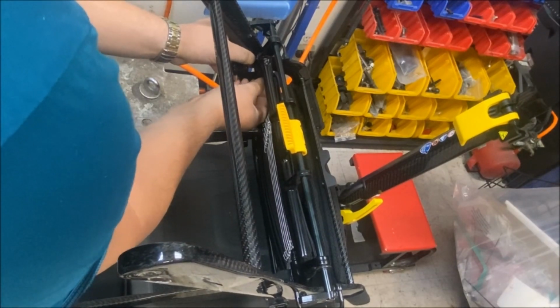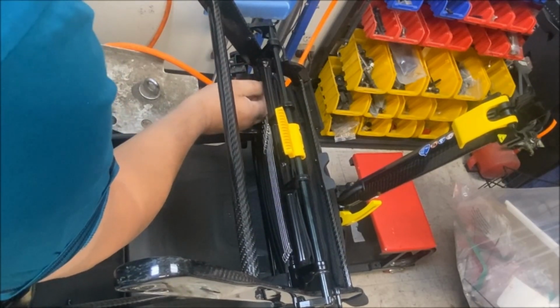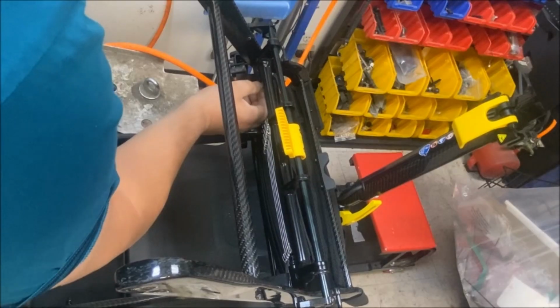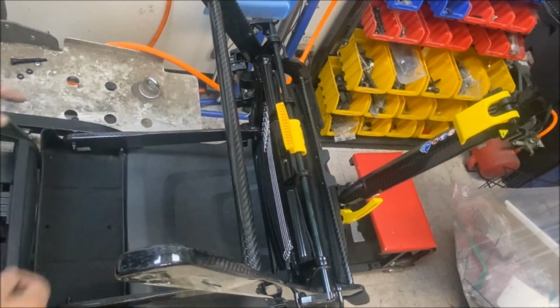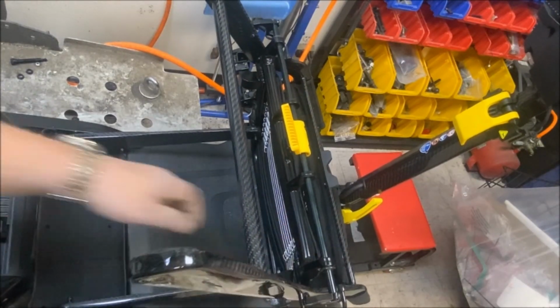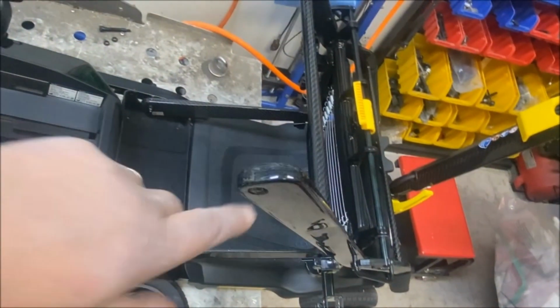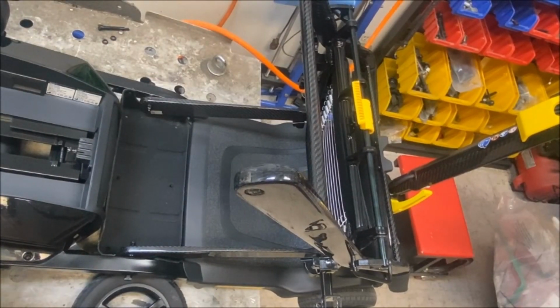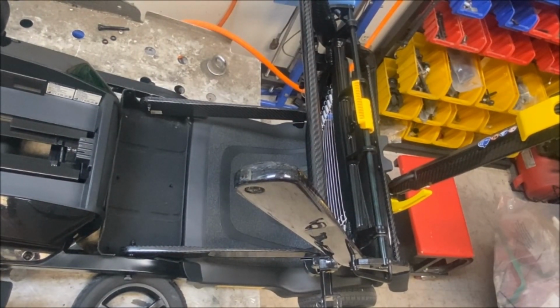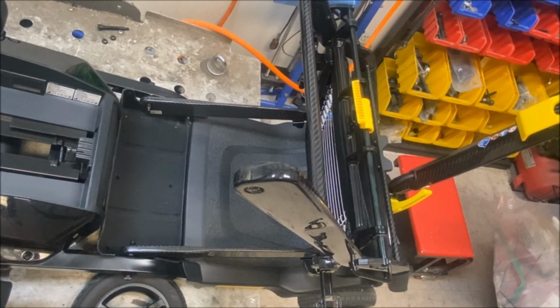So I'm not going to tighten these down until I've got the other ones in, because I need a little extra movement, adjustment, but as long as they're kind of snug. Okay, now I can work on this other portion, this one, which attaches to the frame. That way, that'll go on the wall of shame. Okay, so I've got insert there.